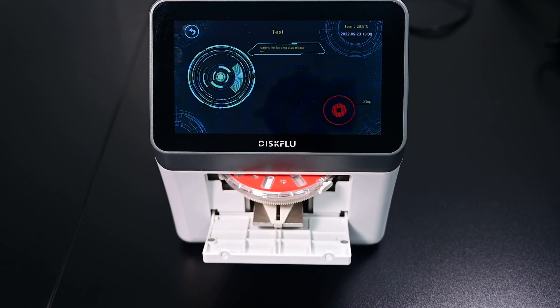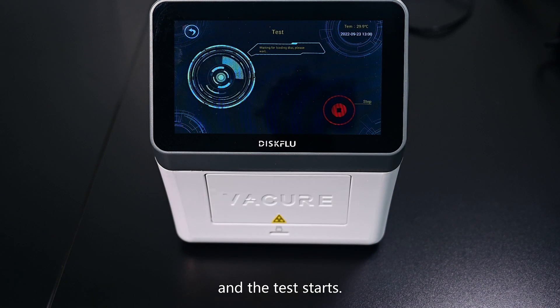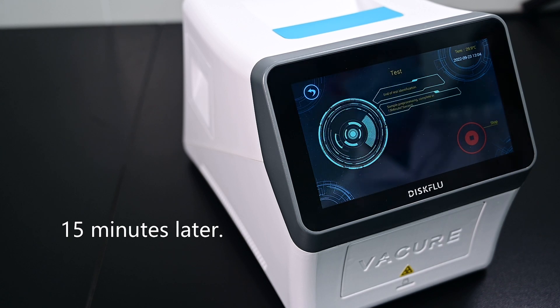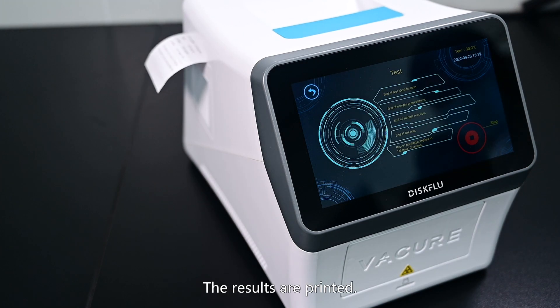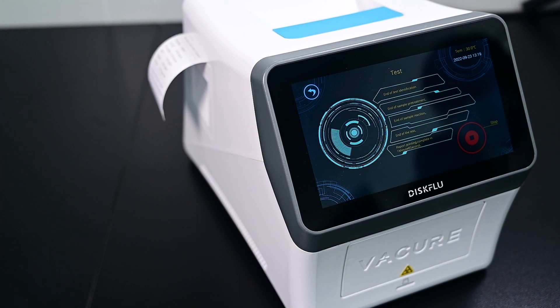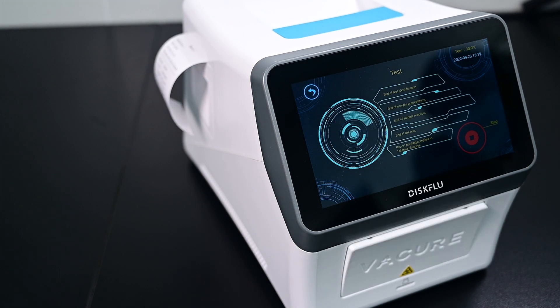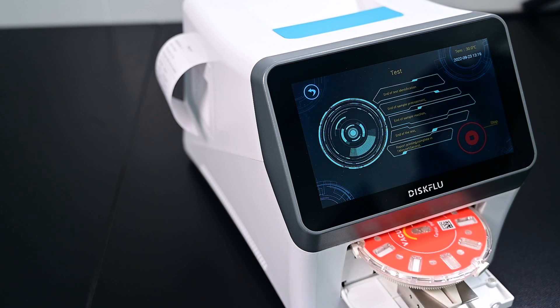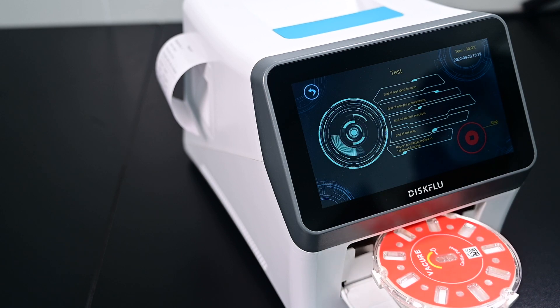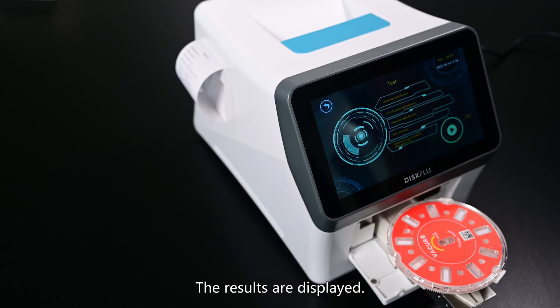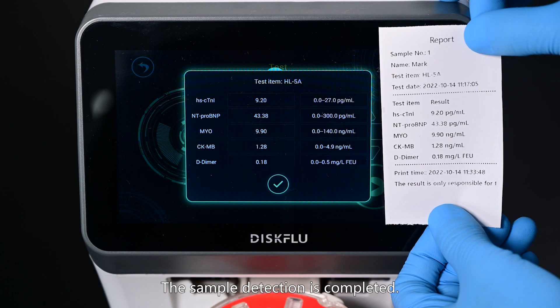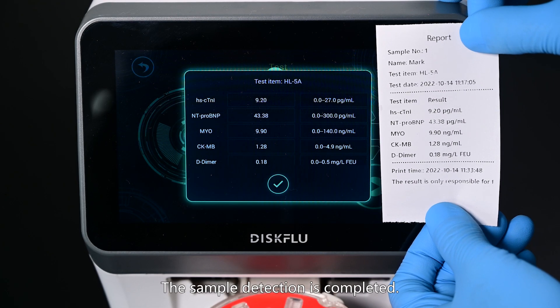The tray enters and the test starts. The results are printed. The tray pops out. The results are displayed. The sample detection is completed.